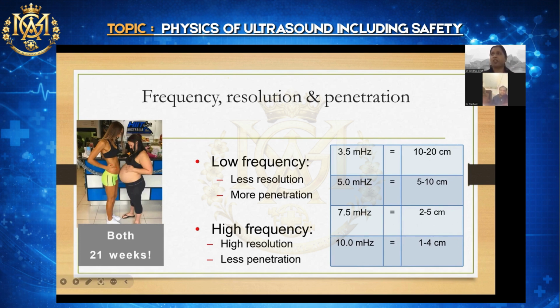So for example, if anybody has a fibroid which is of 18 centimeter, do you think a TVS probe will reach that? Will you get your outer boundary of the fibroid? Or if it's ovarian, if it is 20 centimeter or 14 centimeter, do you think that your TVS probe will give you the entire boundary, you will get the entire plane?